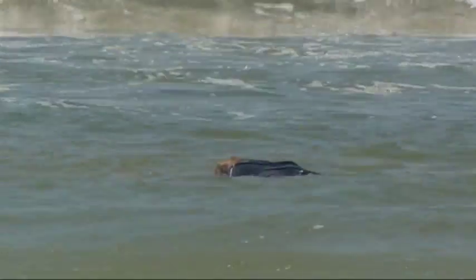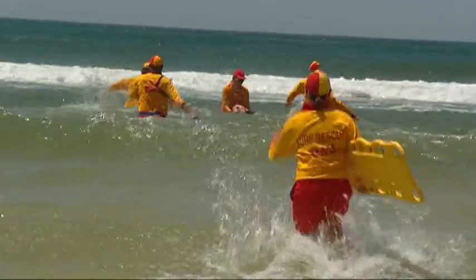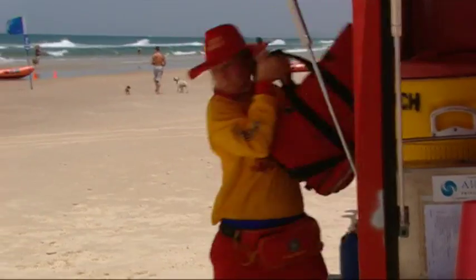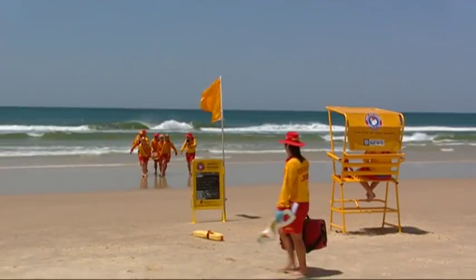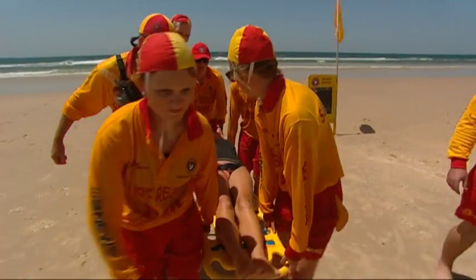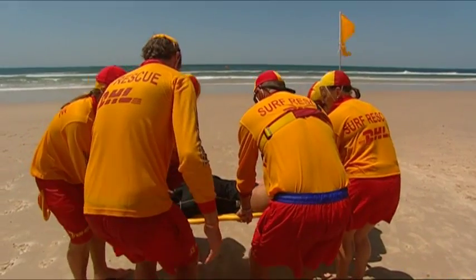Spinal board and collars. The spinal column consists of a series of interconnected bones called vertebrae, which enclose the spinal cord. An injury to the spinal cord has serious ramifications for our ability to function normally, and an injury of the cord may leave the patient paralysed. Spinal injuries can be caused by a variety of physical incidents. In the surf environment, spinal injuries often occur when a patient hits a sandbank with their head or neck and thrusts it in a different direction.